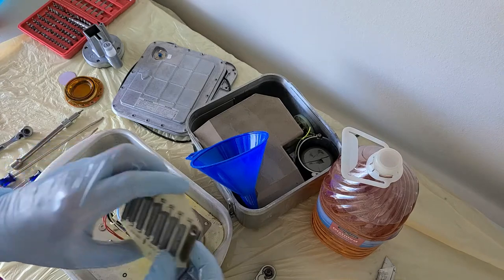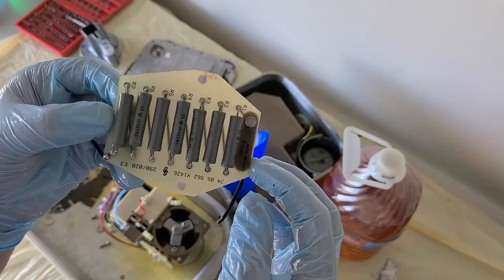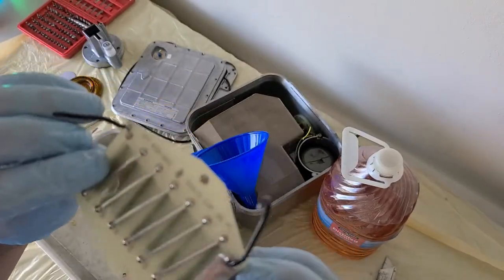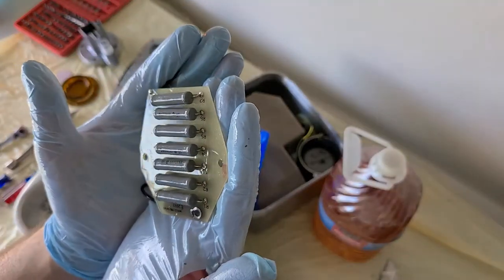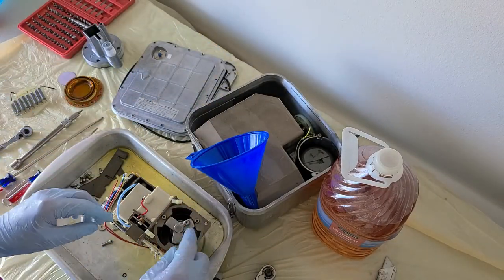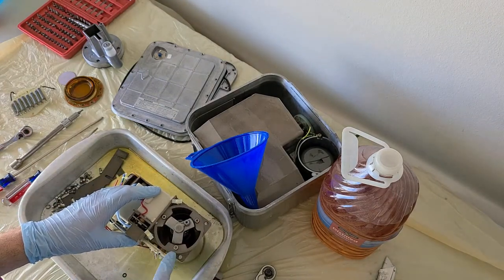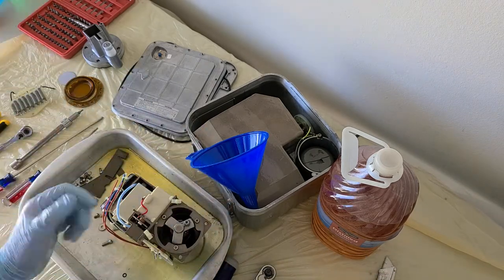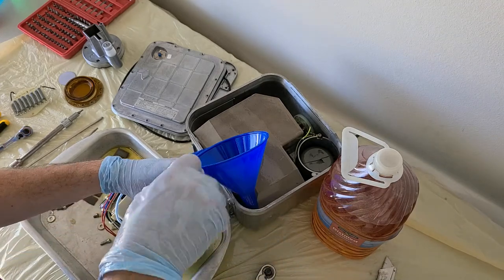All right, here's that board in closer detail. Pretty neat, just a bunch of resistors in series. All right, here's the tube. There's three screws holding it in and we'll be home free. I just got to be careful that when I take out the screws it doesn't go flying down, so I'll go ahead and loosen them up a little bit.